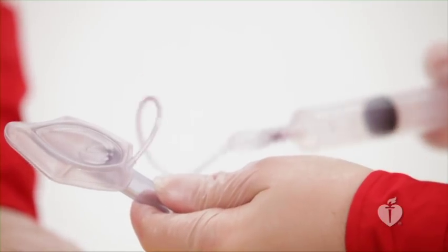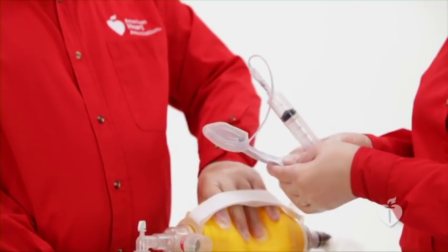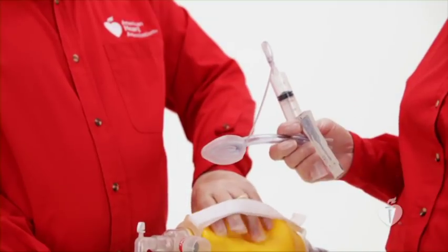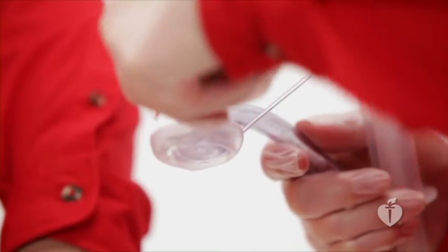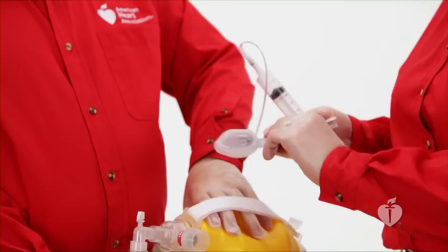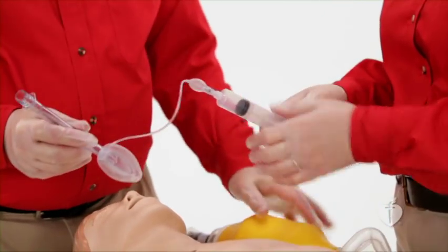Before using the airway, read the manufacturer's instructions and ensure that the mask inflates properly. Then, partially or completely deflate the mask based on operator preference. Lubricate the mask with a water-soluble lubricant. Open the mouth and insert the airway.